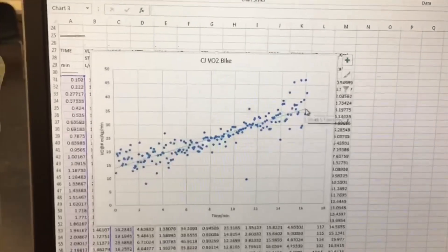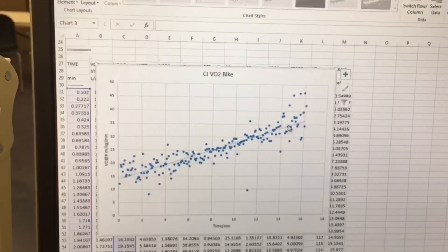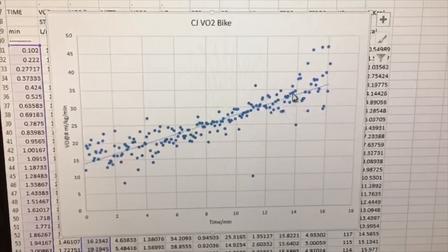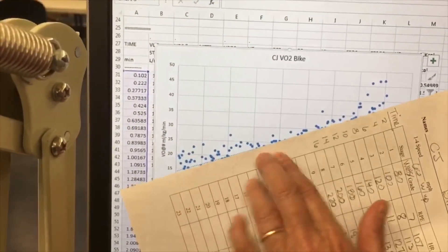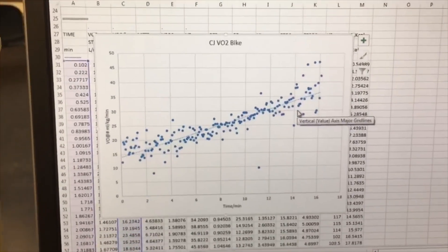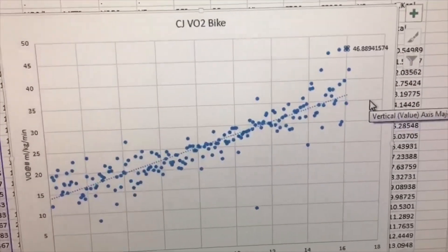We do have a trend line in here, and you can see there are a lot of scatter points above and below. You're looking to see if it spiked up or went flat. Normally you'd have to be at a 19 or 20 and keep it there for a stage or two for it to level out. I wouldn't necessarily say it plateaued at this point — to have a true plateau, you would have to keep that 19 or 20 for a couple more stages. His high point was labeled at 46.889 milliliters per kilogram per minute.